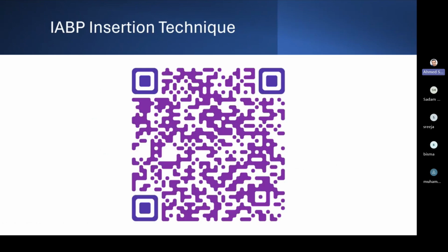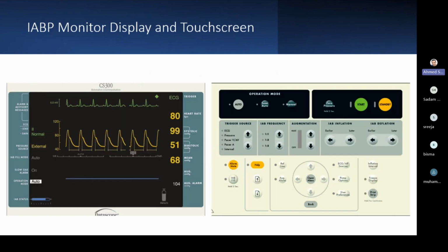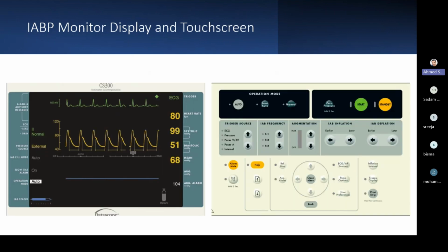And for the insertion technique of the intra-aortic balloon, you can scan this code, and it will give you access to two high quality videos to show you how to prepare and insert the intra-aortic balloon. This is a display monitor and the touch screen for the intra-aortic balloon, of different devices and different companies.